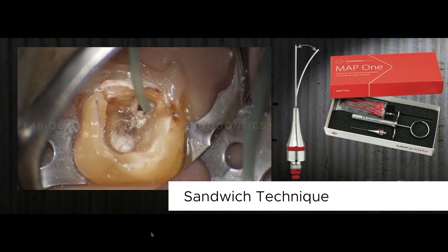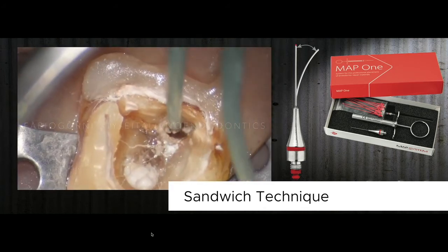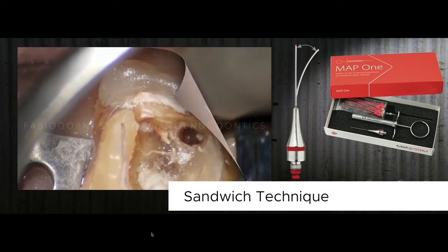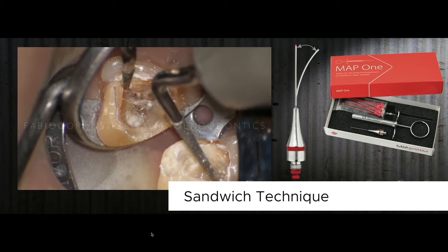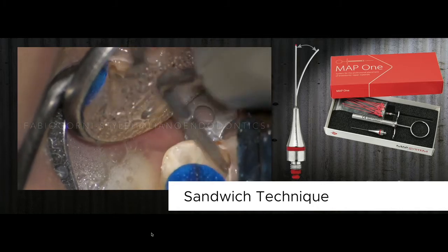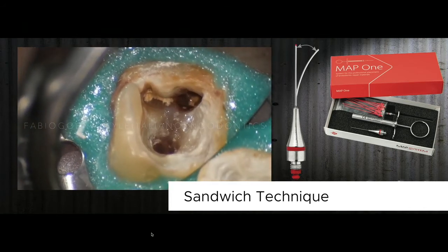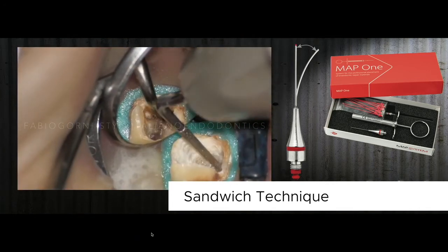Here is another case, more recent, where we can show also the first part of the treatment. The first part of the treatment is really, really important, because we have to clean everything, and through a correct access cavity we have to understand exactly where the problem is located. Using ultrasonic tips we can change the shape of the access a little bit. We can clean the area between the mesial orifices, and now the situation is more clear. We can see above the orifice a perforation in the furcal area.